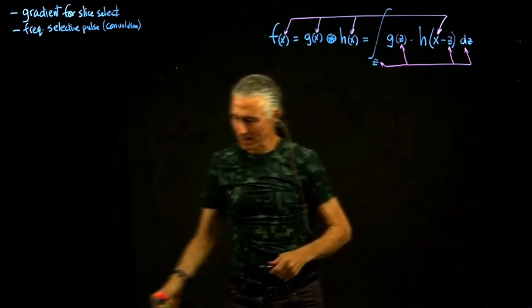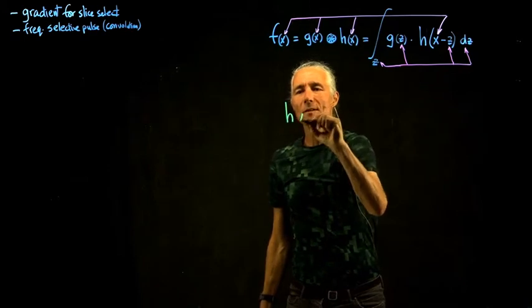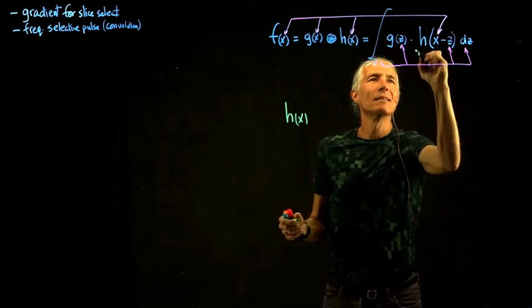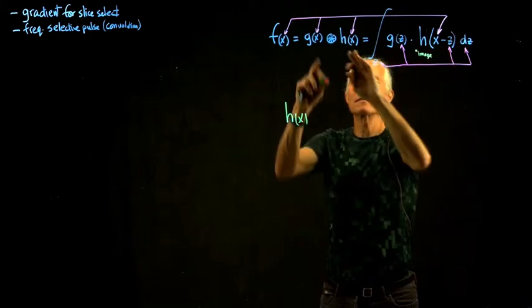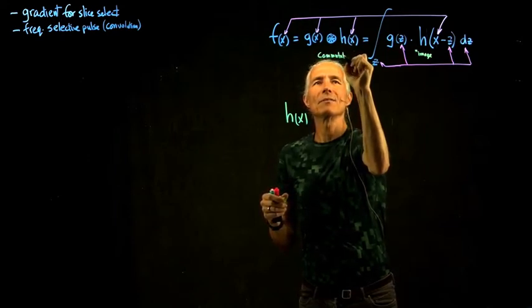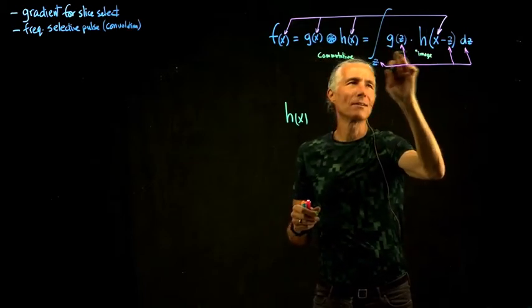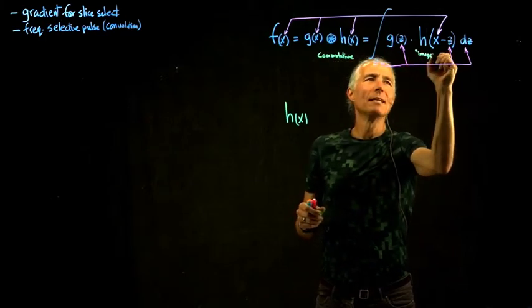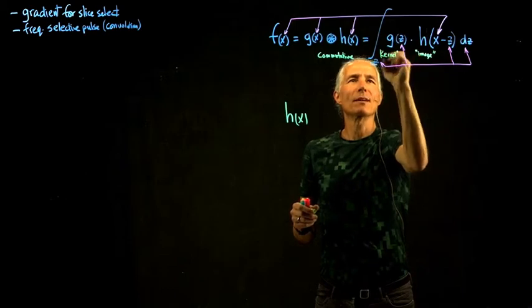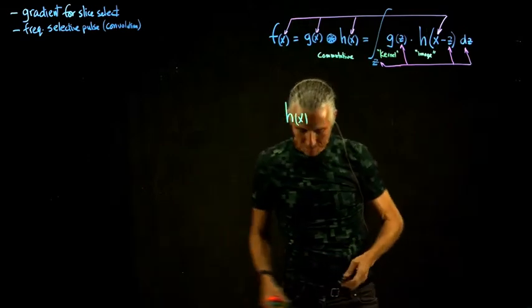One way of thinking of it is as sort of an image. You can think of this guy as the image. Convolution is commutative, so you can do it the other way also. And in the literature, sometimes they call G the kernel, sometimes they call H the kernel. It can go back and forth, but we'll call this the image, and then we call this the kernel. So this is like our blurring. You can think of this as our blurring filter, the G. So here's our image.